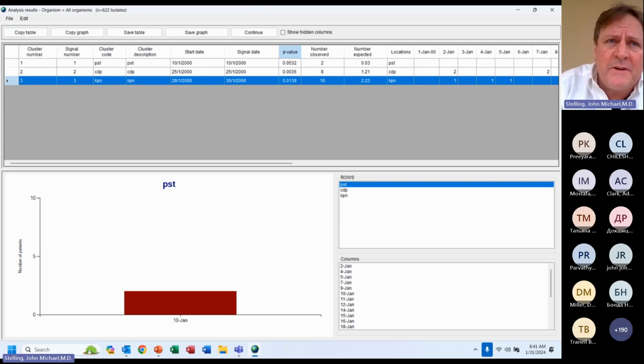If the recurrence interval is like 3 months, 8 months, I can use my judgment as to how important this is. It might depend on the room. If it's the neonatal ICU, I would like to investigate. If it is CRE, I would like to investigate. So you can use your judgment based on what the recurrence interval or the p-value is. So as you can see, the purpose of the threshold is that you can go up and down on the sensitivity and specificity by changing that.